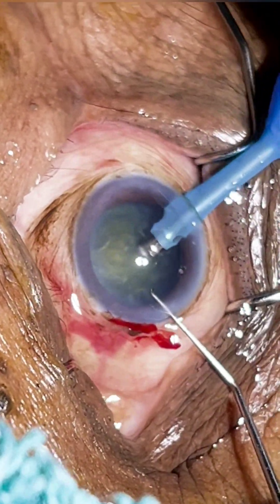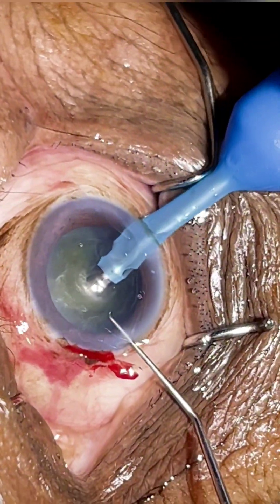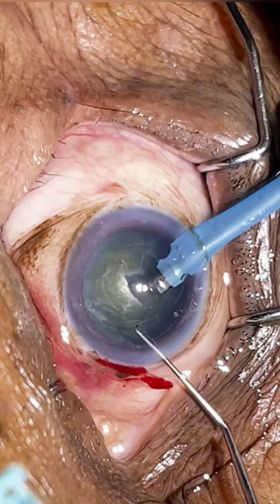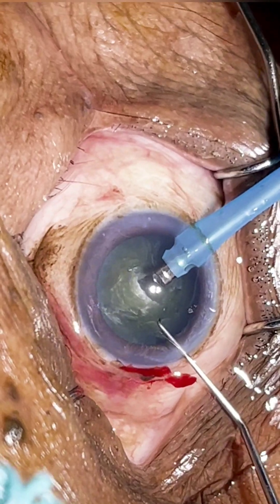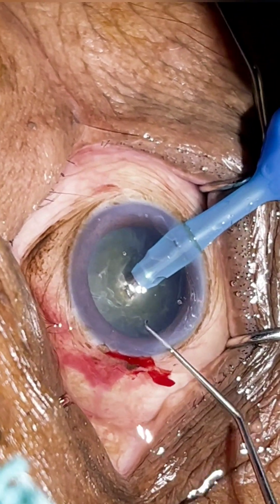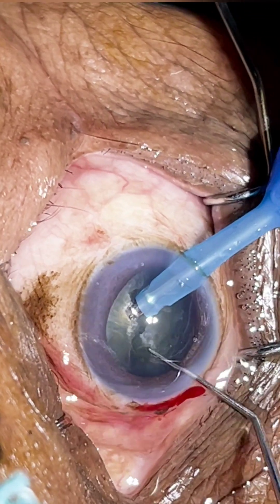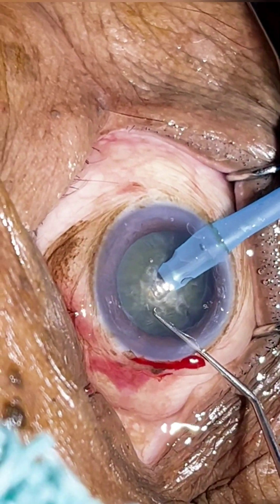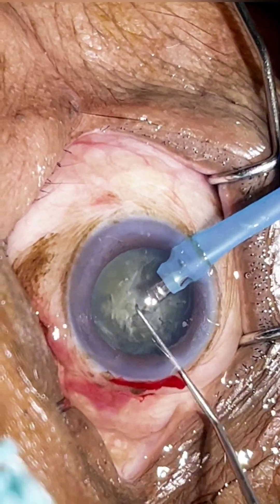Now I'm trying to give a groove before direct chopping. We could have directly gone in with the phaco tip, but as this is a case where the endonucleus is very much elastic, we prefer to have a groove first. Now I'm going into the matter of the nucleus and just chopping it into two hemi-nuclei — and nicely, it got divided.